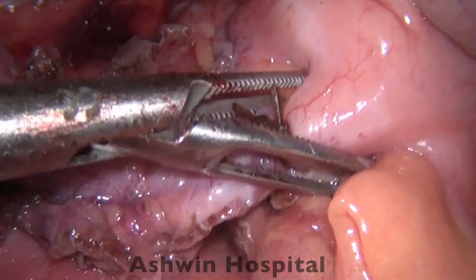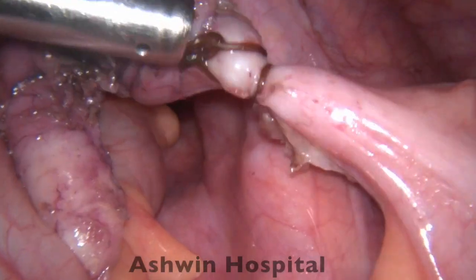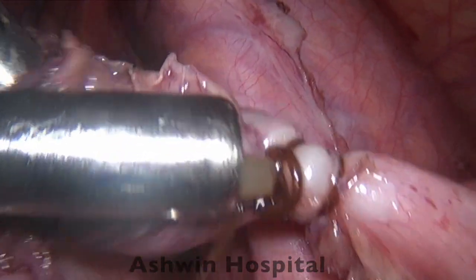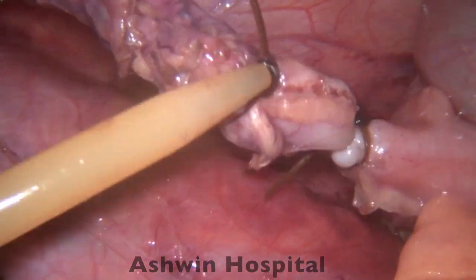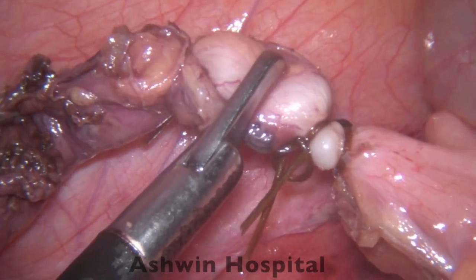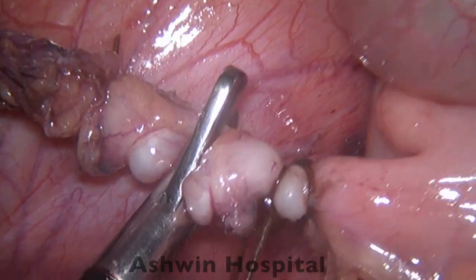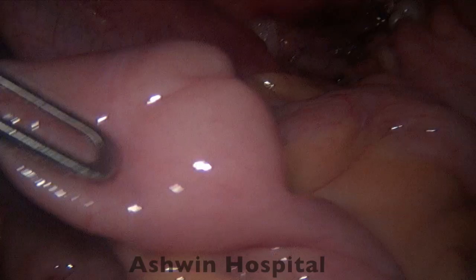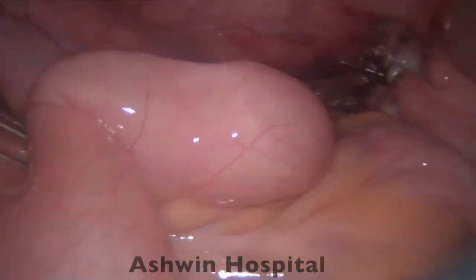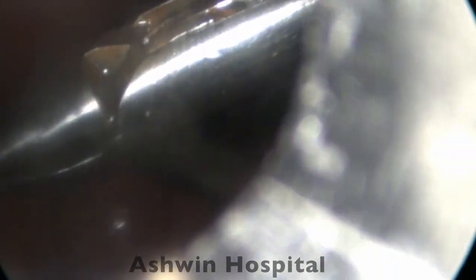Applying an endo loop on the cecum wall would lead to a cecal fistula later, making a simple operation more morbid. We apply two endo loops proximally 5 mm apart, then milk the appendix again and place a third endo loop distally to avoid spillage of fecalith, which causes paralytic ileus. We use betadine-soaked gauze to chemically cauterize the stump. A bowel walk is performed to exclude Meckel's diverticulum. The camera is changed to 5 mm, a claw forceps is used, and the specimen is removed through the 10 mm port ensuring the appendix does not touch the skin.